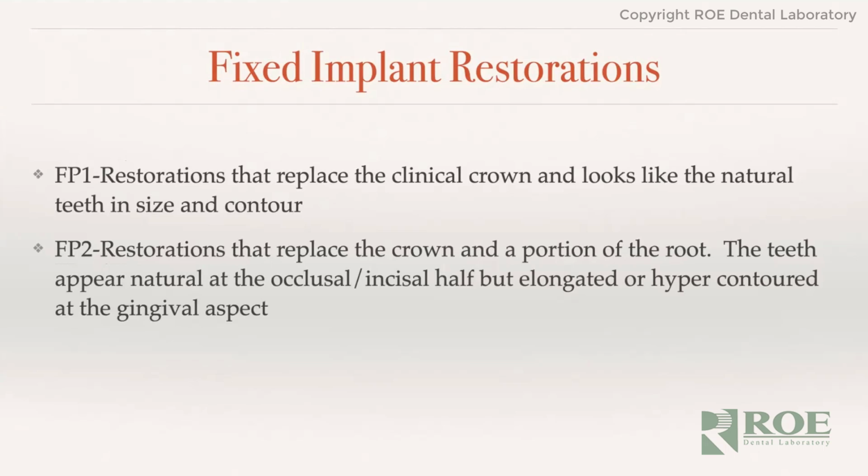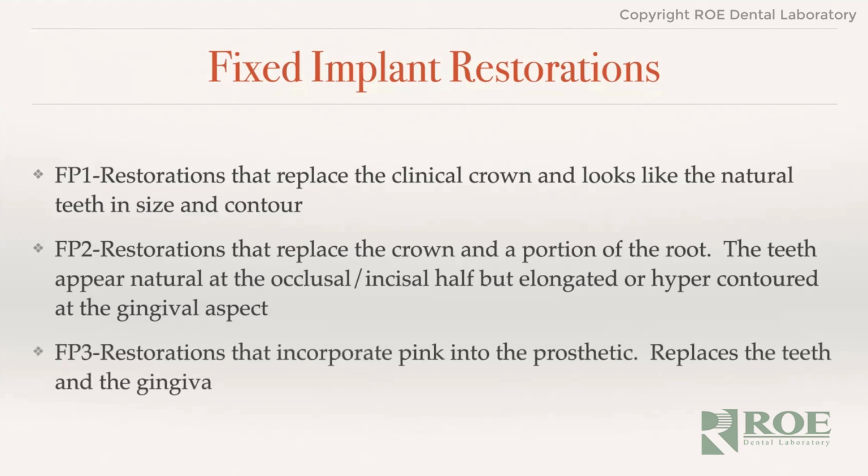These are when you can see the roots of the teeth, or you have really long-looking teeth in a patient that might have a low lip line. And the FP3s are going to be restorations that incorporate pink into the prosthetic and replace the teeth and the gingiva. So anything with pink is automatically an FP3 in our office. And when I talk to lab, that's what I expect. And I mention that to the technicians when I'm talking with them on how I want things to be.